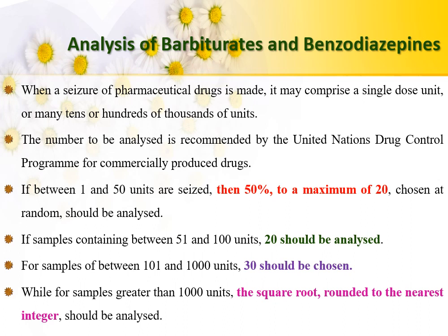When a seizure of a pharmaceutical drug is made, it may comprise a single dose unit or many tens or hundreds of thousands of units. The number to be analyzed is recommended by the United Nations Drug Control Program for commercially produced drugs.